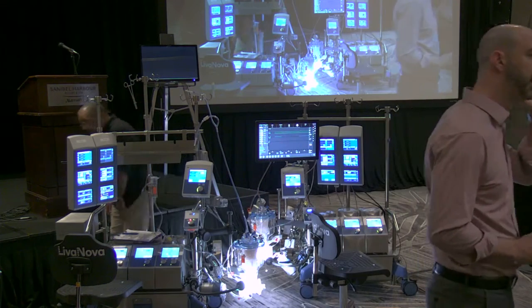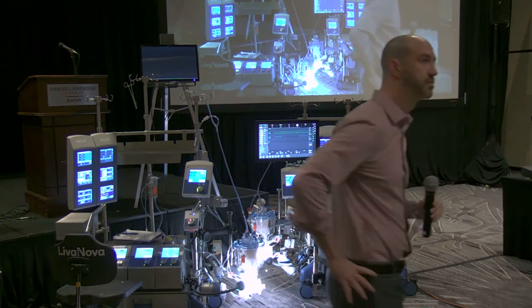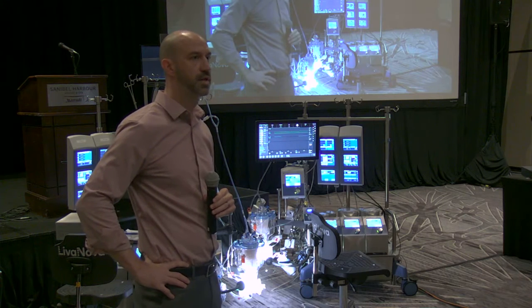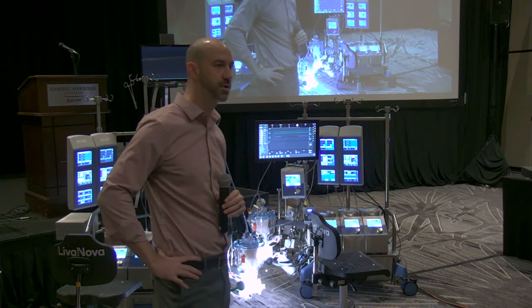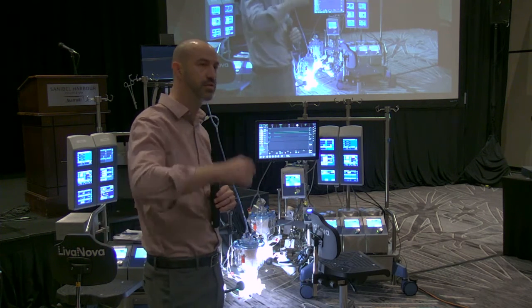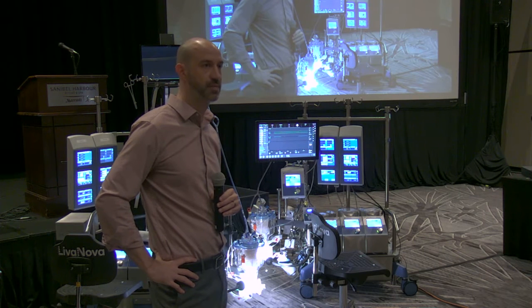What's that? I couldn't hear it. Is the interface with the anesthesia monitor Bluetooth or hardwire? It's all hardwired, yeah. All hardwire? Yeah. So that's a good point. There are a multitude of devices around the operating room that we all love and use from different vendors. It'll plug into our system and capture that data.